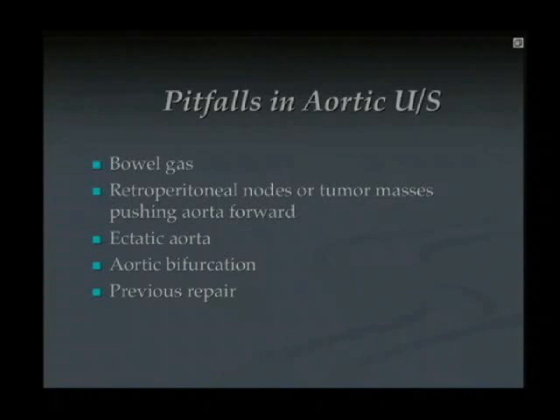Right. This brief lecture is on the abdominal aorta. You could have an aneurysm of any artery of the body: cerebral, popliteal, iliac, etc. So obviously we're not going to be that expansive, but you could have an aneurysm of your iliac artery, absolutely. And if you are suspicious of that, get either a formal study or a CT. Obviously, it's a matter of following that iliac artery down. But that's again beyond our scope. If you look at our practice guidelines within that ASAP scope of practice, iliac artery aneurysm is really not on that list. It's abdominal aorta.